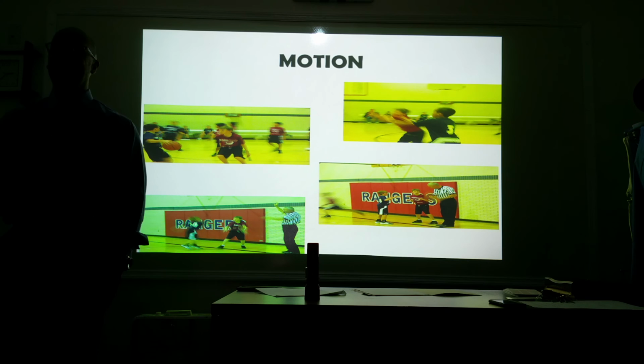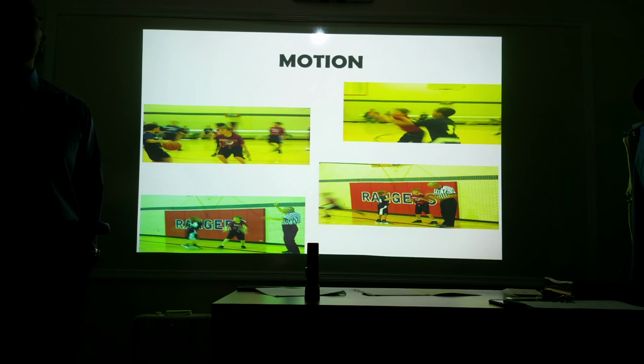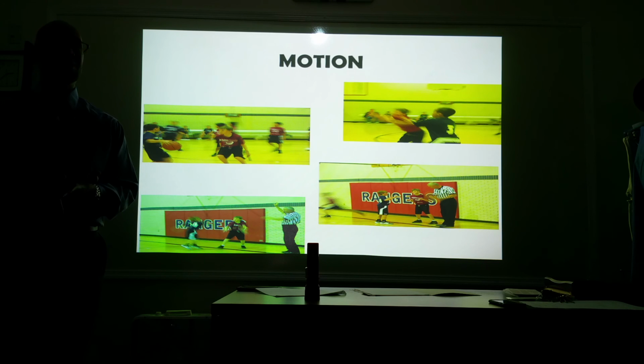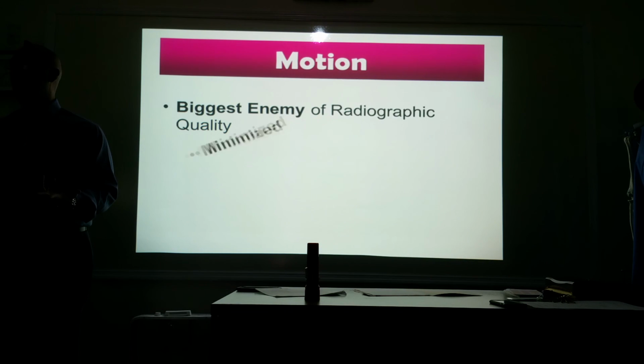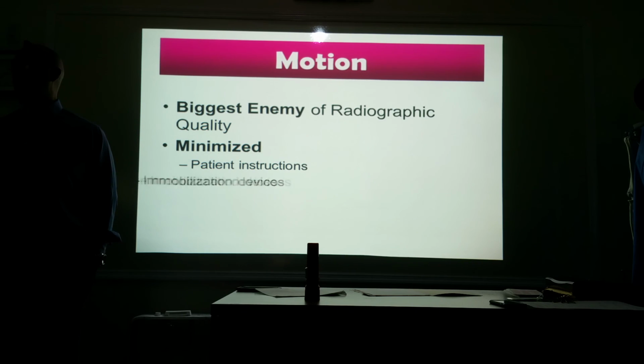Let them know what you're going to do. I'm going to be taking an x-ray. I want you to hold still for me. Don't move. Hold your breath. If they're not able to control that because of maybe some muscle spasms, they're young, they're elderly, short exposure time is not going to work, use tape. We carry tape with us all the time. You know, nurses carry their forceps and their stethoscopes. We carry tape. So patient instructions, immobilization devices, sponges, sandbags, tape, Velcro, sheets.